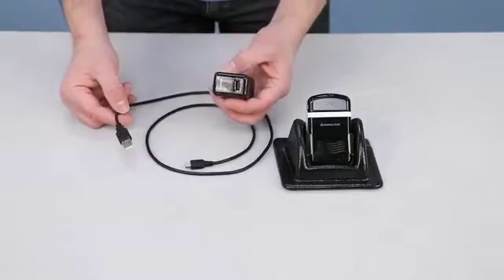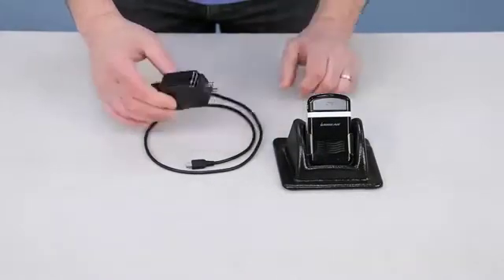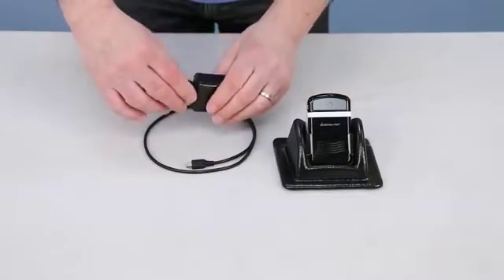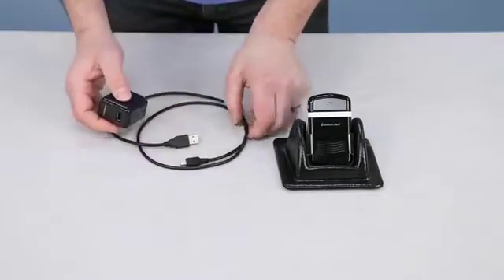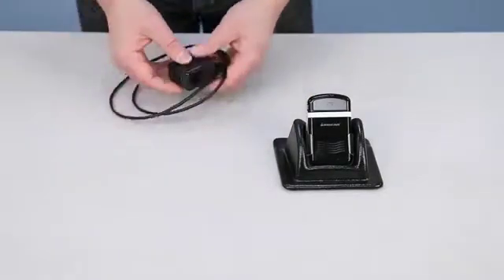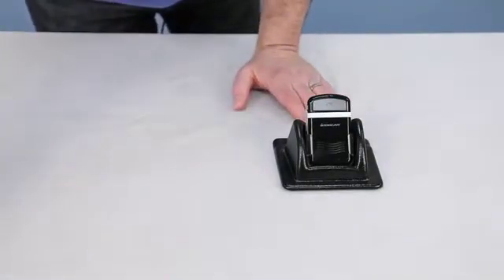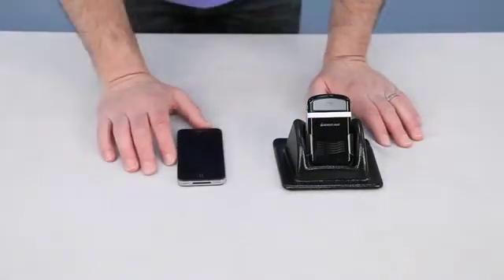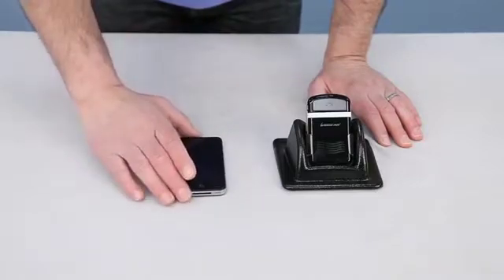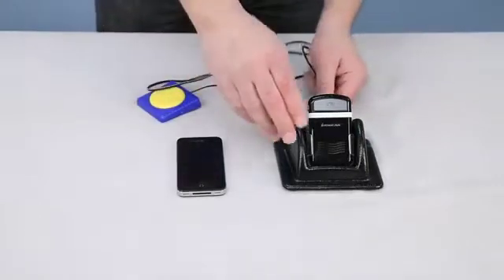We also include an AC wall wart which allows you to plug this into any AC outlet and charge it that way as well. Again, it takes about three hours to fully charge the unit. Once you have the unit charged up, we're going to use an iPhone here for demonstration purposes. You can pair it to up to two phones so you can switch between two different phones. I'm going to use our switch here just to show you can use this with the switch.